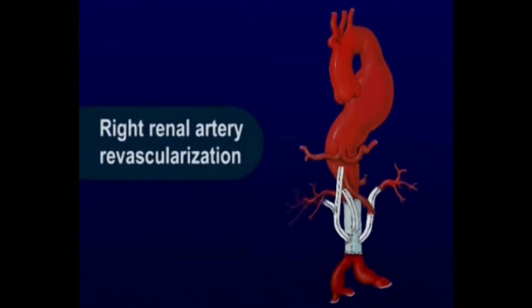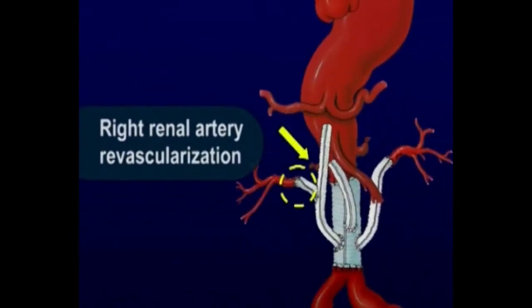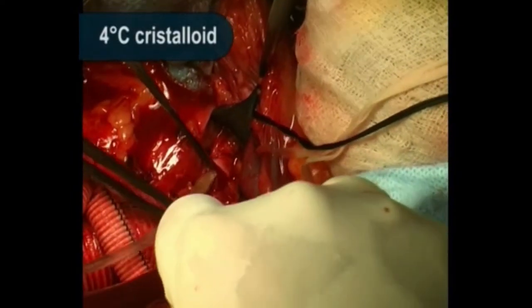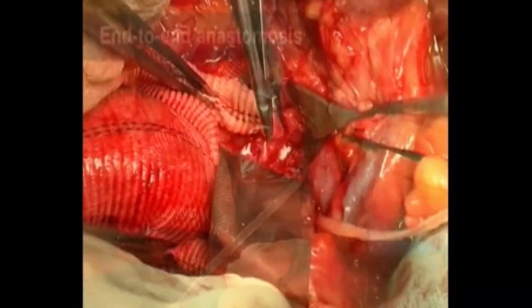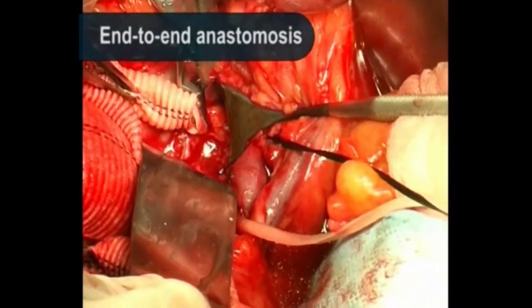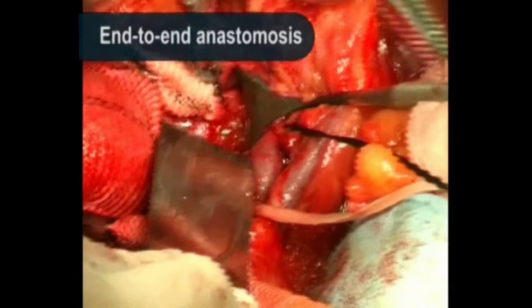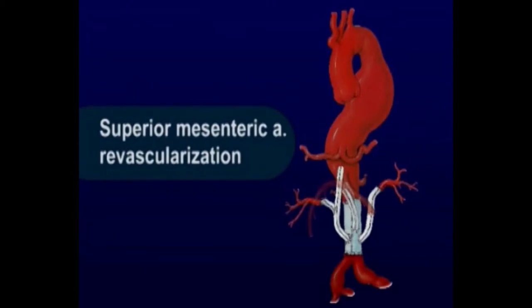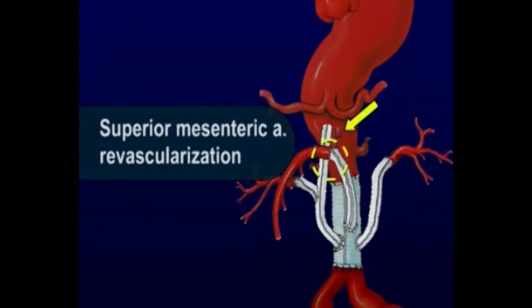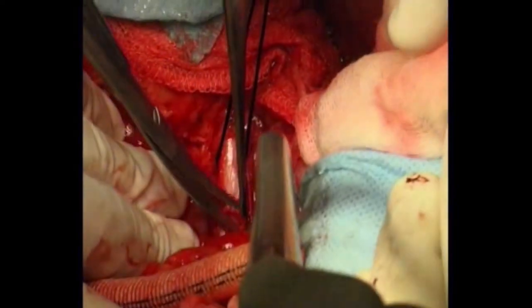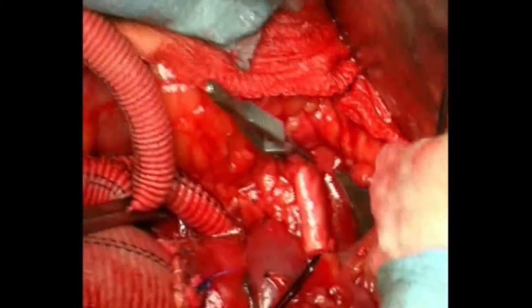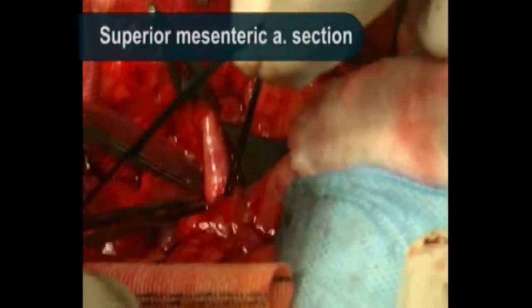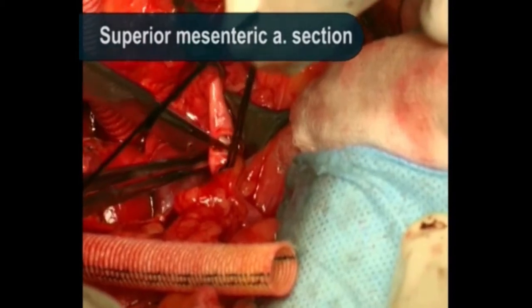Using the same procedure, the right kidney is detached from the aorta and re-anastomosed to a side branch of the graft. About three centimeters of the SMA from its origin are isolated and mobilized. The artery is then cut close to the aorta and re-attached to the graft. The risk of mesenteric ischemia during this step is usually very low, thanks to a well-developed collateral network.